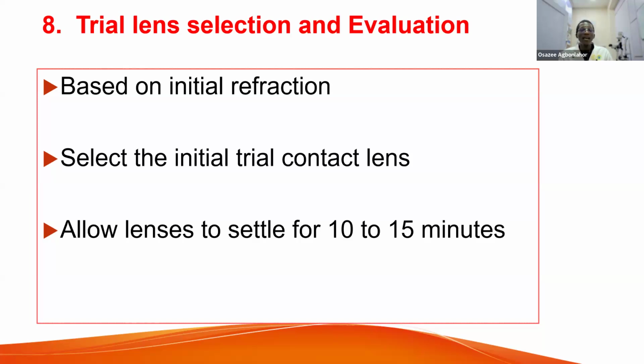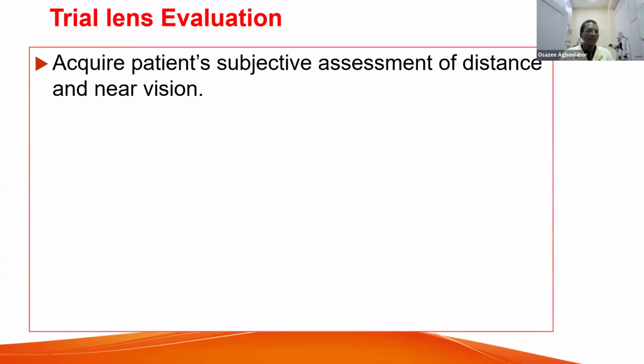I assume that we do know what to do. But I have a question later for us, maybe at the end of this presentation. I have 15 minutes, so I need to run. So you evaluate the trial lenses and see which of them is best for the patient.